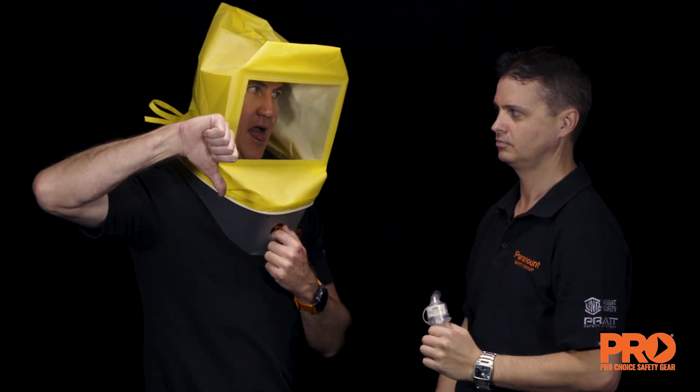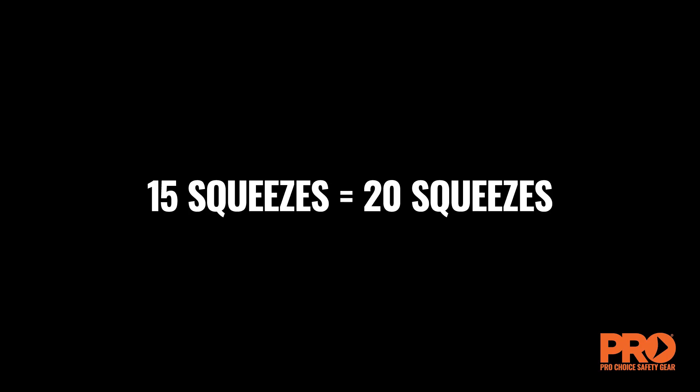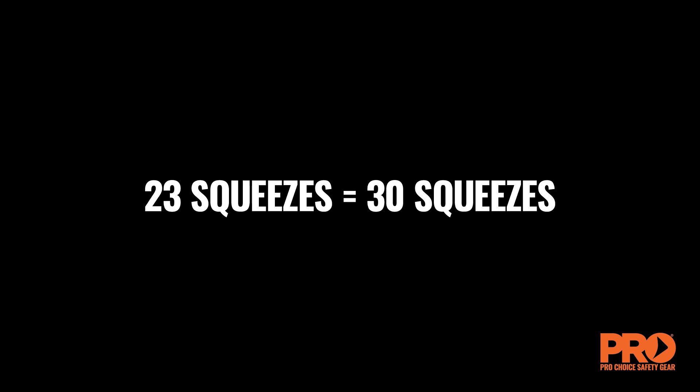If tasted, note the number of squeezes as 10 and proceed to the fit test. Round up to the nearest 10 — for example, 15 squeezes equals 20, and 23 squeezes equals 30.